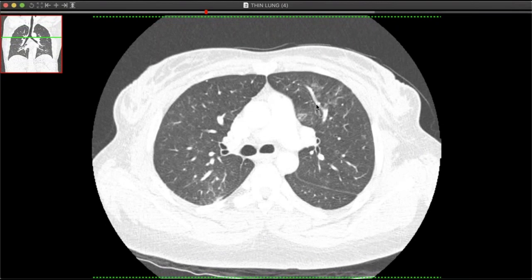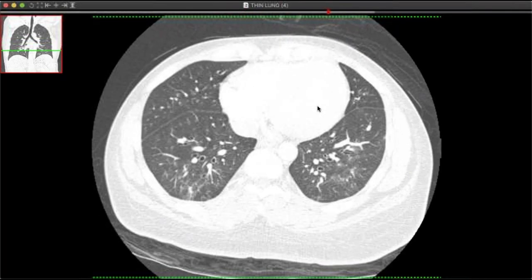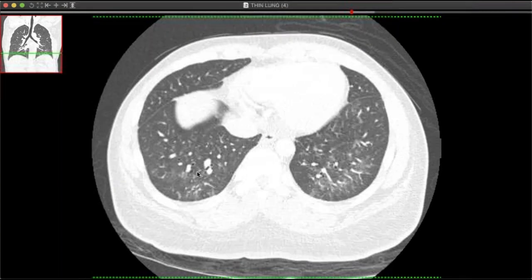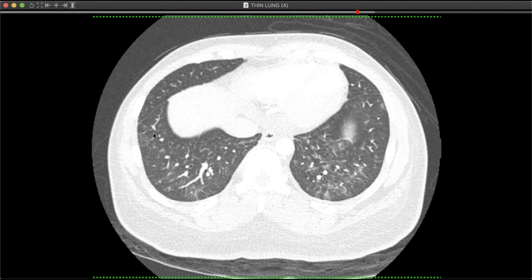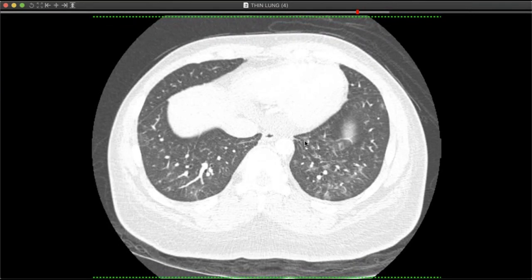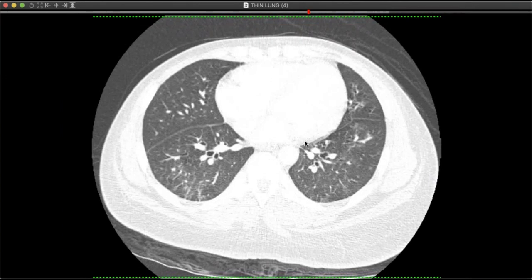This particular case is a little bit more nodular. I probably would have favored infection more, just because a lot of them look like centrilobular nodules. But with that amount of hypoxia, it always makes me think about some bleeding. She didn't have any pleural or pericardial involvement, but has skin involvement and had some long-term disease. So a case of lupus-associated diffuse alveolar hemorrhage.